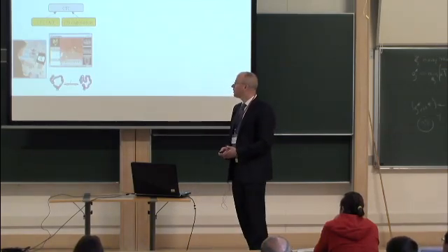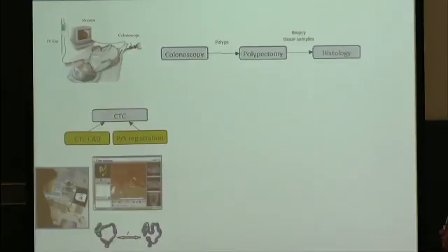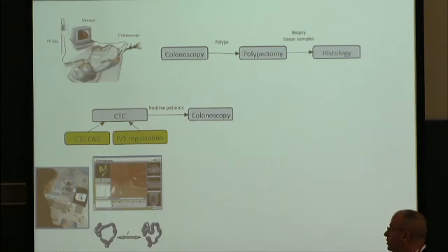In addition, for the radiologist, we're also developing prone supine registration tools. And as I mentioned before, we have 2 scans of the colon. The prone supine registration tries to bring these 2 surfaces of the colon into spatial alignment. And I'll be talking about this in more detail in just a few minutes. So the patients that are positive for polyps can then be referred to colonoscopy.